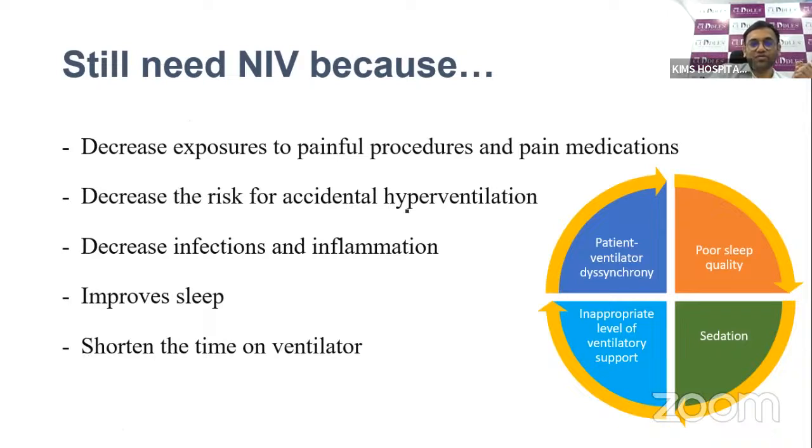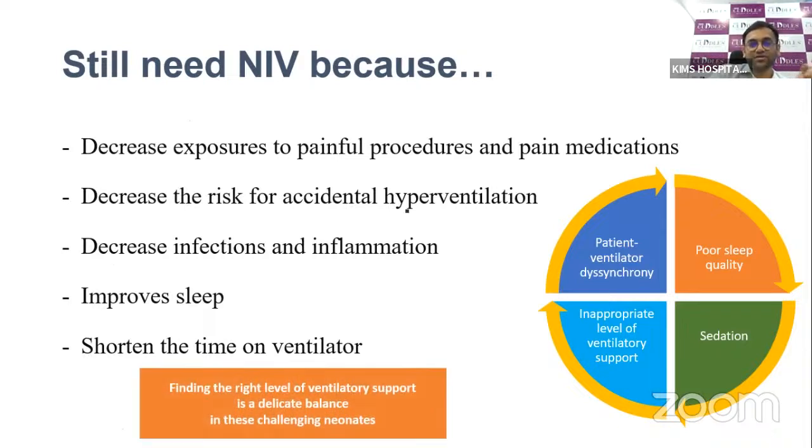But still, we don't know which ventilator setting and support is right for the baby, because the newborn's physiology is changing and the disease process will evolve or improve. So providing the proper ventilation to the baby is always a challenge in the neonatal period.